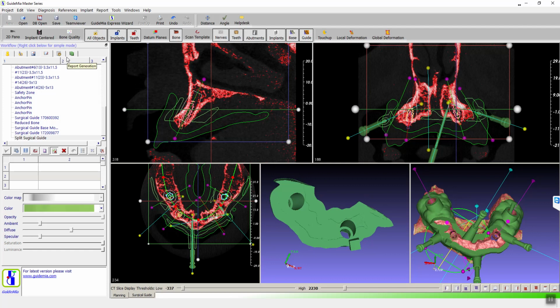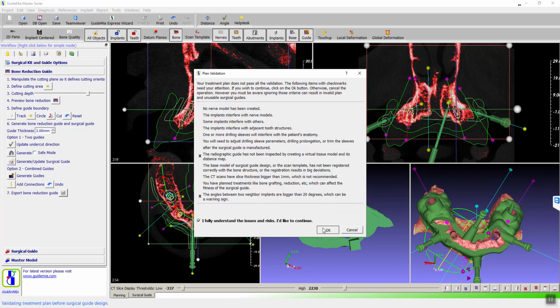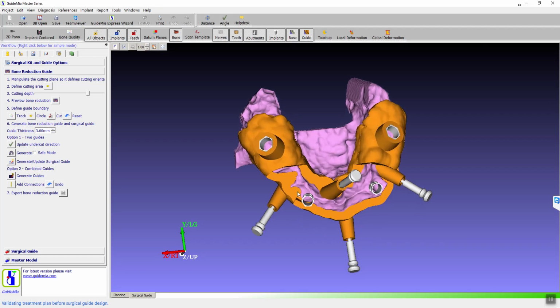No. For now, it's just plug it in and take it out, easily taking out. We can create a little bit of retention later, but right now we don't. So if he offsets the square, can it be more stable that way? We can make it tighter. You know, because the object printer got like 28, 30 microns errors. We can make it tighter, so you can press in and it won't go out easily.